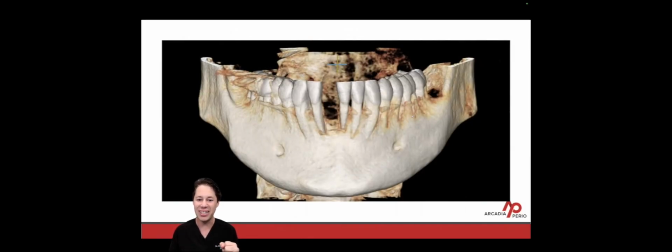What a challenging case. But like I had told you before, there are subtle nuances in this case that we need to pay attention to. Notice my bone heights, mesial and distal. Although I have a large defect, there might even be a little bit of bone right here, right at the crestal portion, which is maintaining all the tissue heights.